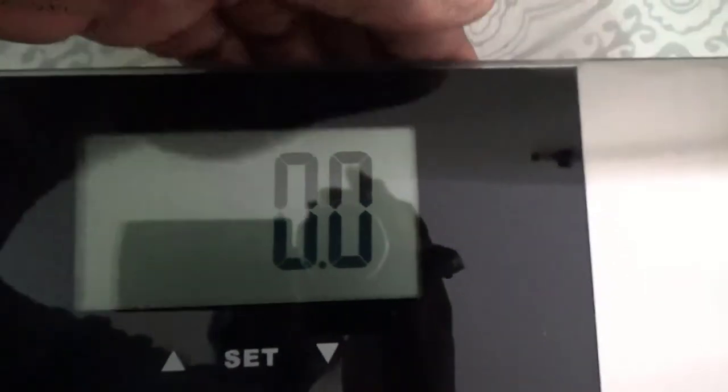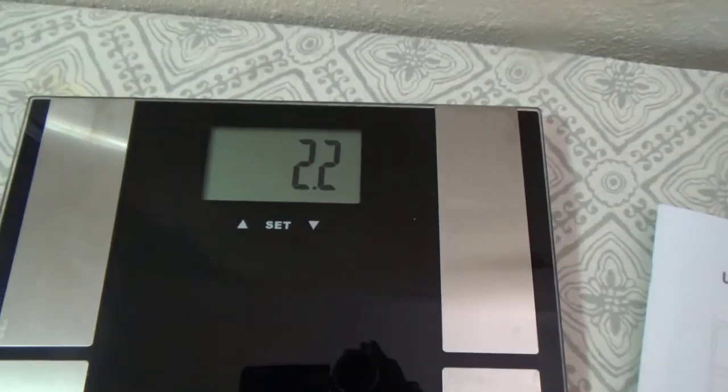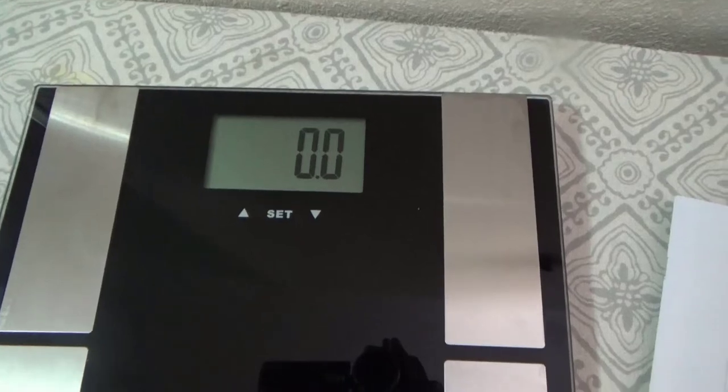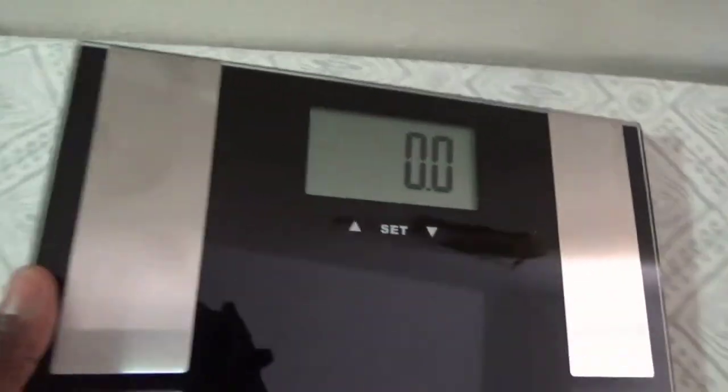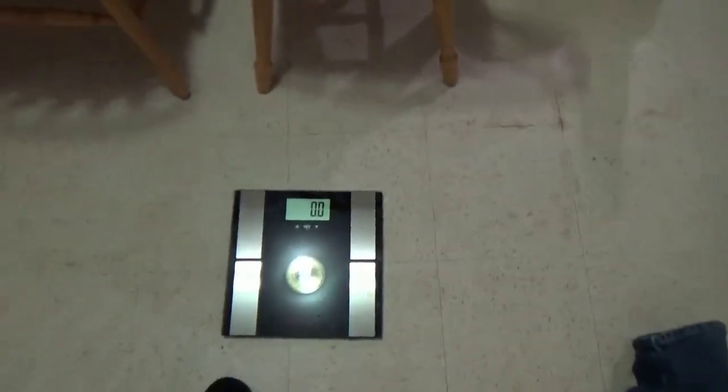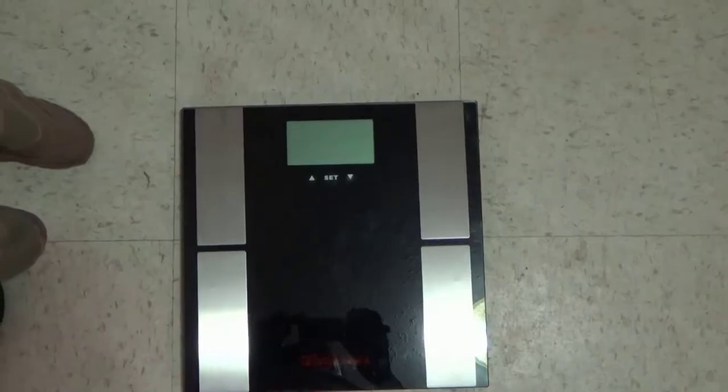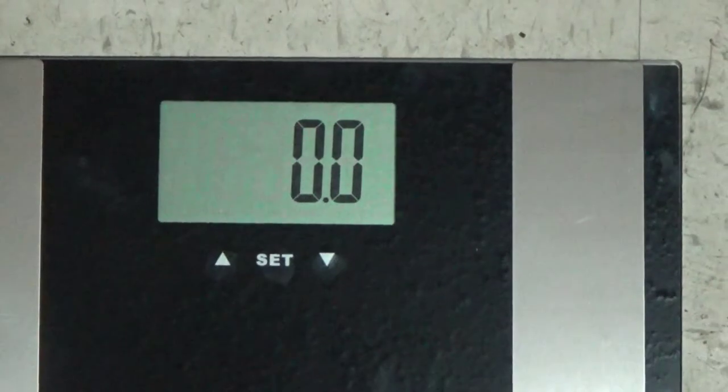I'm gonna set mine to pounds. Once you got it set at pounds, it'll zero itself out. Put it on a solid surface. That's all you have to do if you just want to get your weight. You put it on a solid surface and just step on it and let it zero itself out.